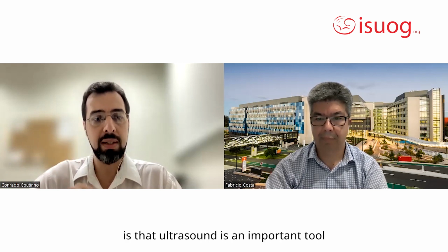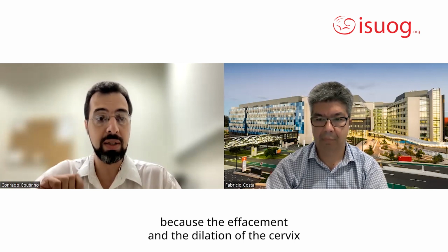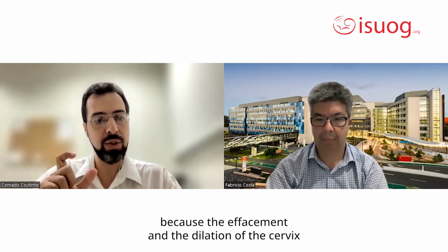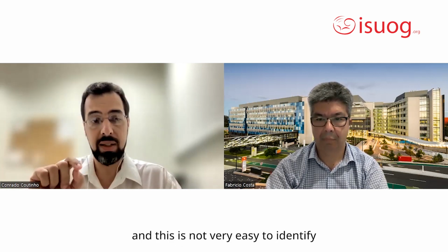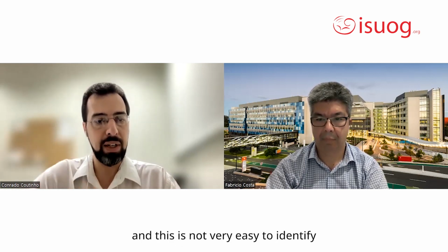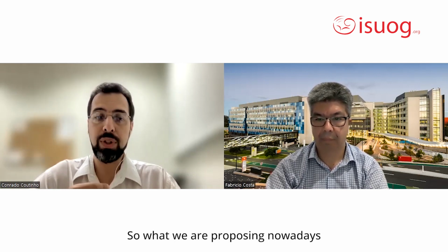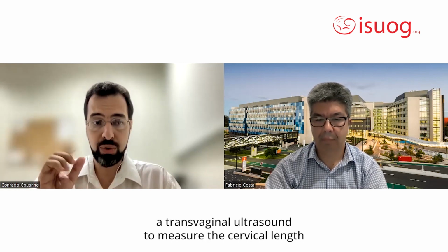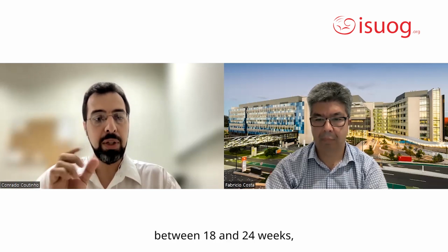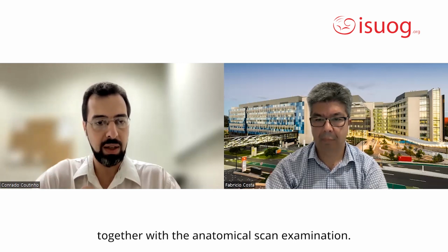What we know nowadays is that ultrasound is an important tool to identify high-risk patients in the general population, because the effacement and the dilation of the cervix starts from the internal os to the external os. And this is not very easy to identify using your digital examination. So what we're proposing nowadays is that every patient should have a transvaginal ultrasound to measure the cervical length between 18 and 24 weeks, together with the anatomical scan examination.